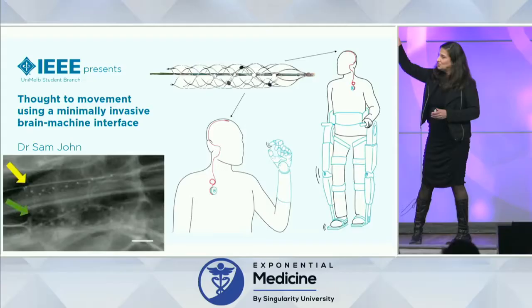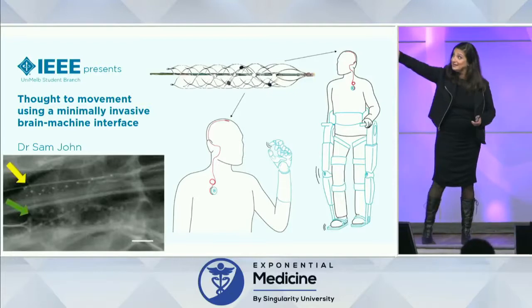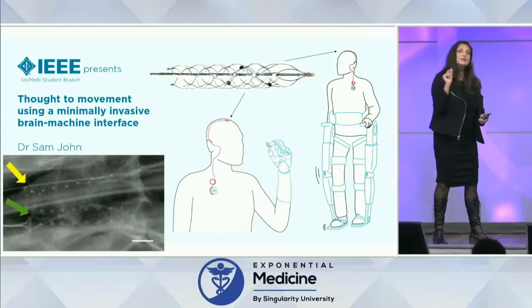It can actually be used to put coils into brain aneurysms so people can stop bleeding. But we do it with a little bit of conscious sedation, a little bit of numbing medicine. This is not major heart surgery, brain surgery. Well, this group had the great idea, why don't we take the cage that we normally thread through that vein, and let's thread it with electrodes.